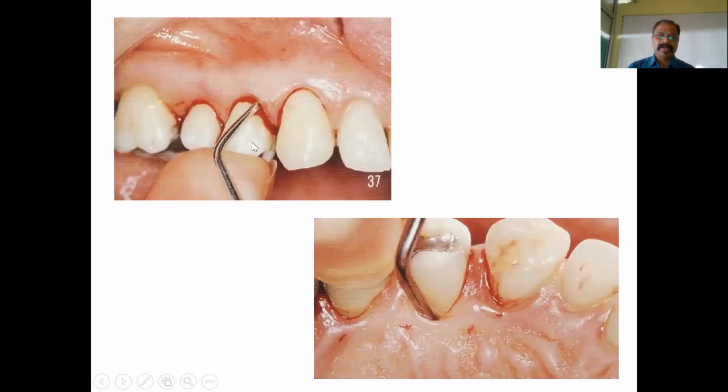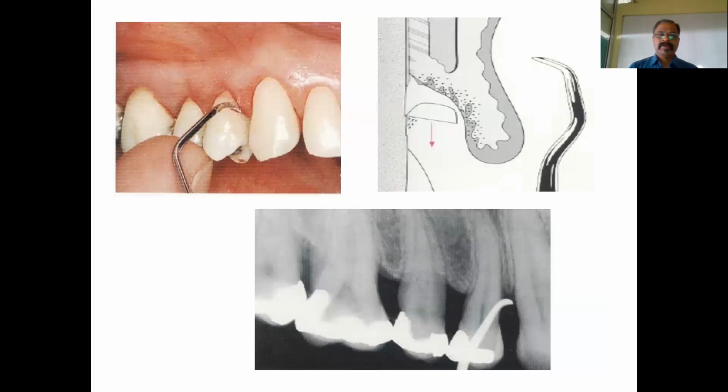Right, now you're going to carry out the same thing all across your tooth surface. You go buccally from the mesial to the distal, and then from the mesiopalatal to the distopalatal, making sure that you remove complete subgingival deposits. This is again the same thing. Now you see the root surface has been completely cleared of the local irritants.